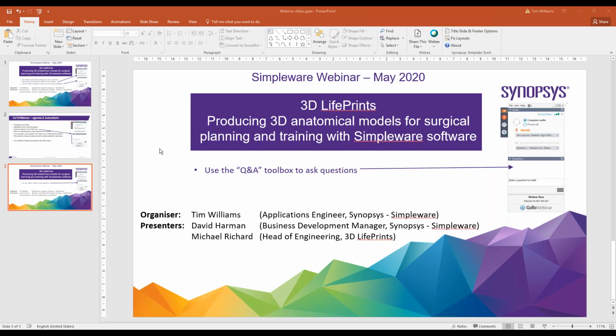Over in Wrightington, we produce hundreds of drillable and operable bone models for the orthopedic center. So unfortunately, in this business we operate, there's not really a one-size-fits-all answer for your question. All I can say is we are an extremely flexible company who always looks to supply the exact needs of the centers we partner with.